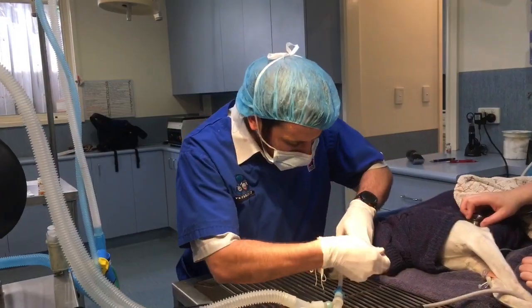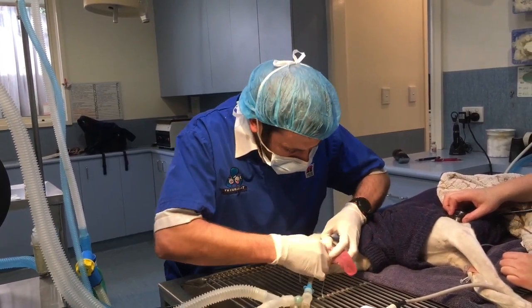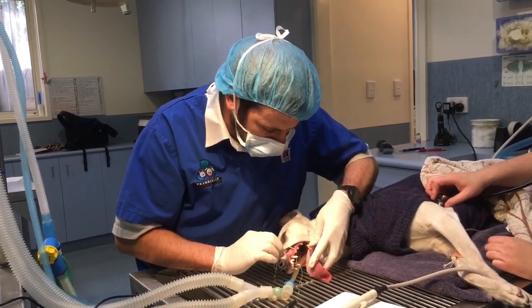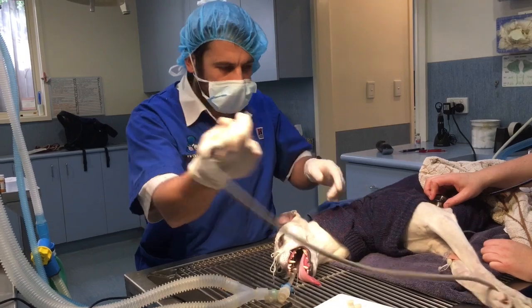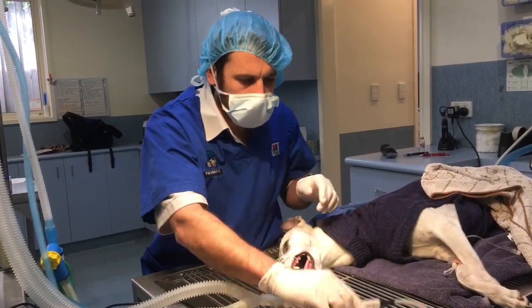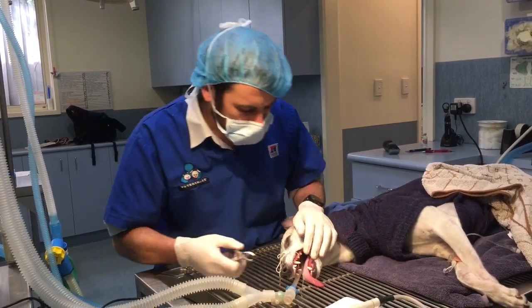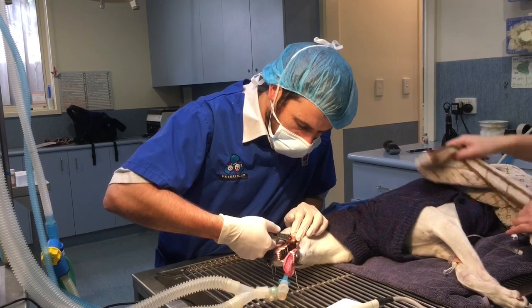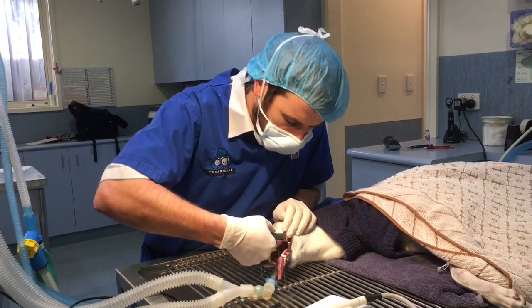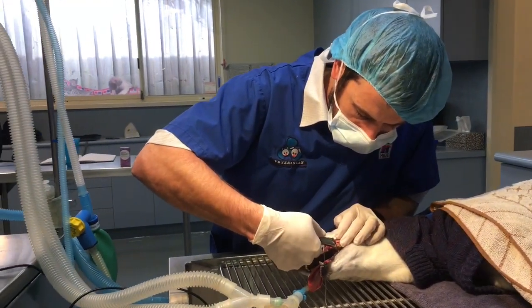We're going to let Rosie get a little bit deeper. We need to x-ray her first, then we're going to bring her over and do a dental. So we've taken Rosie's x-rays. What we do — we pop a swab down the back of the throat to try and stop fluid from going down there. We use an ultrasonic scaler, similar to what human dentists use, to go in and clear off all the tartar that's stuck to the teeth. Unfortunately for Rosie, because she's owned by a very negligent vet, she does have a reasonable amount of tartar. We also use tartar extractors to help clear most of the stuff off.